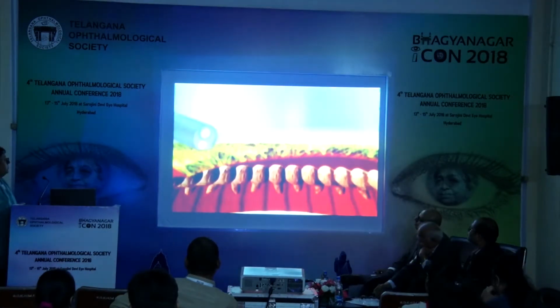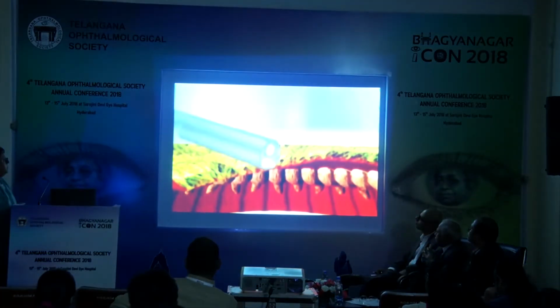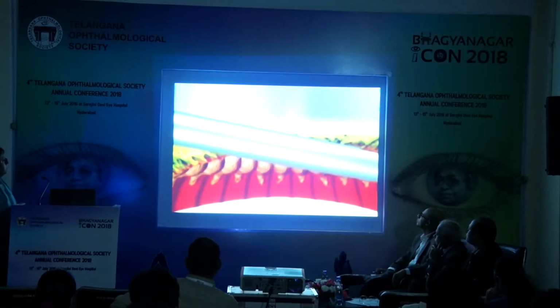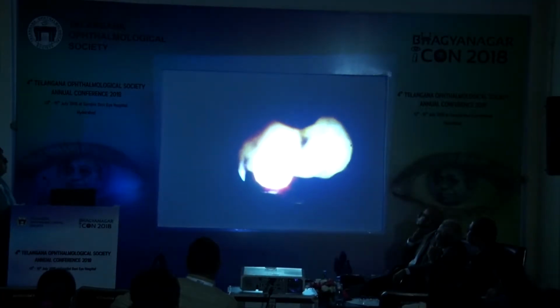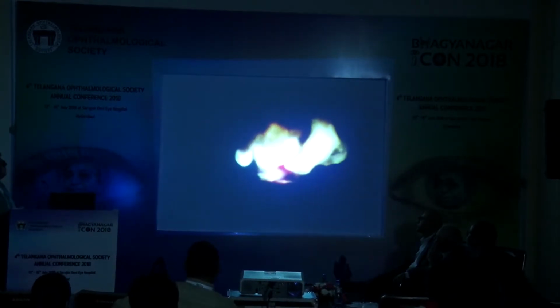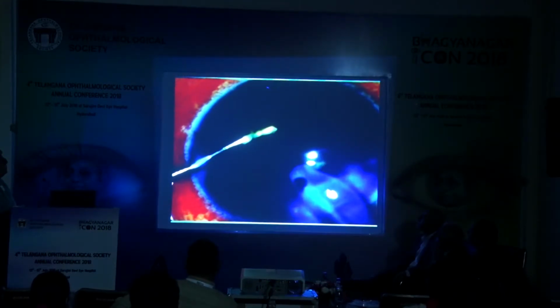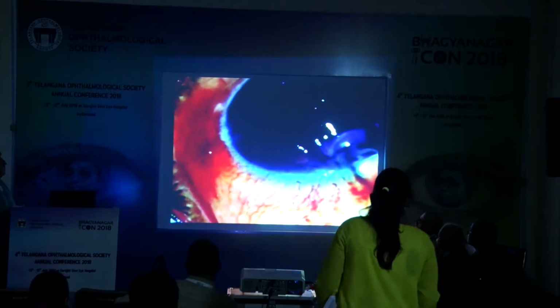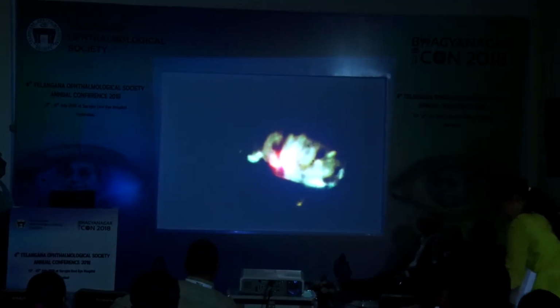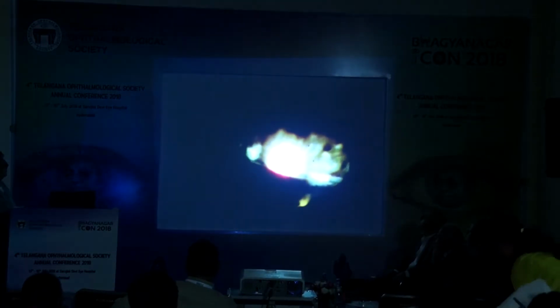In endocycloplasty, diode laser energy is delivered endoscopically to the posterior aspect of the ciliary processes with the goal of shrinkage but not destruction. The surgical technique involves phacoemulsification and IOL surgery performed prior to endocycloplasty.